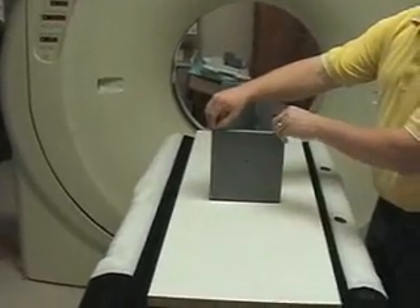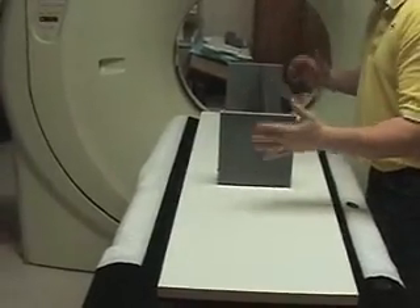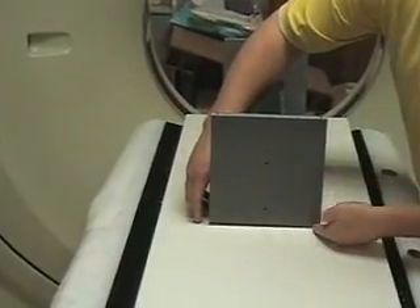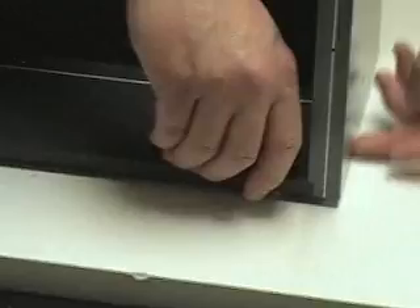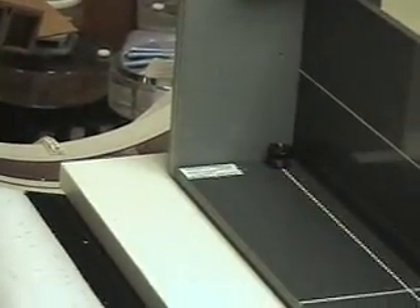When you put the phantom on, you need the pegs towards the foot of the couch. Once you have that, everything is pretty much set. Now you just need to level this portion of it by moving the thumb wheels inside, moving them up until it's level — so you can make movements down or up if needed. Do the same on the other end cap: move it up to get it level. If you have a level, you can use it to start.